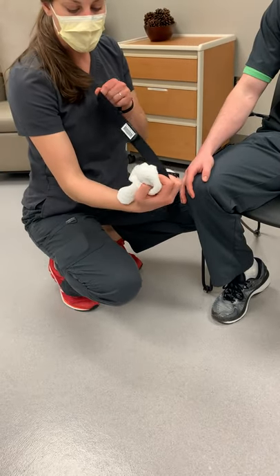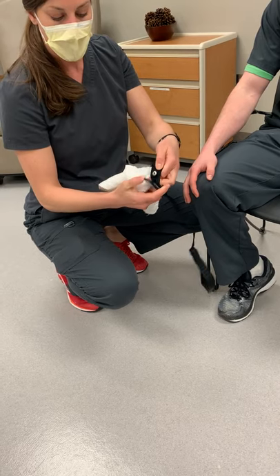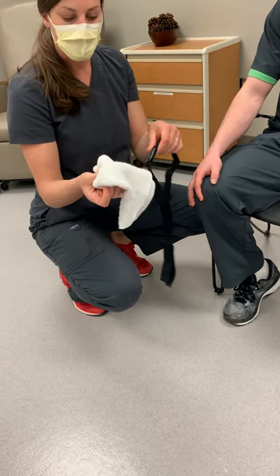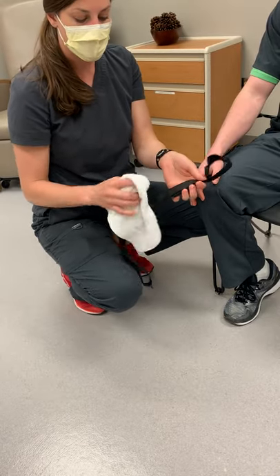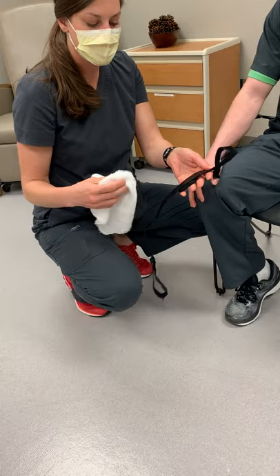All right, we have a Polar heart rate monitor. We have the puck that's snapped onto the actual strap. First you want to make sure that those are snapped into place. Next, I have a wet rag and we want to make sure that the back of the strap is wet down. It doesn't need to be soaking wet, just a little bit damp.